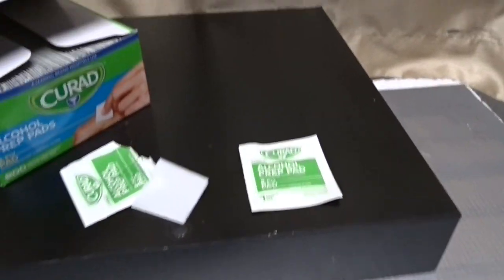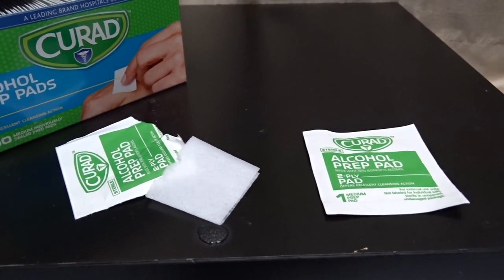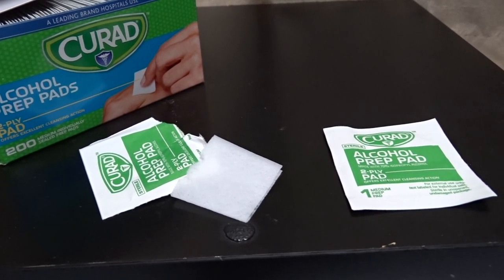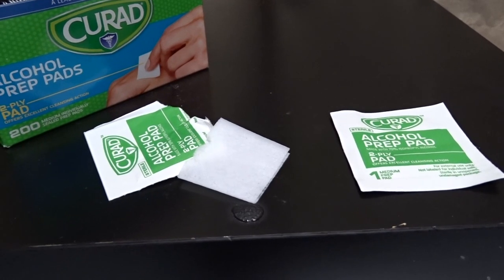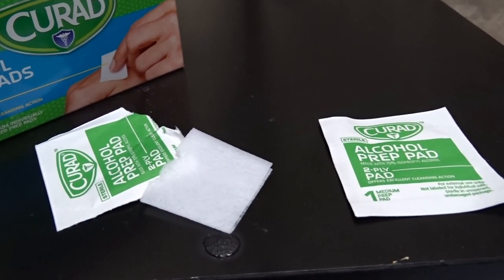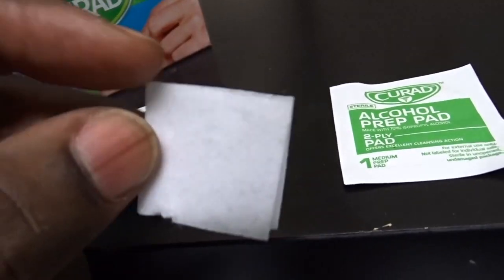At my work we use these — I work in a lab — so when you're getting ready to bleed someone, like poke their arm with a needle and extract blood from a vein, you need to prep that area. You have to wipe it down really well with a swab pad like this.